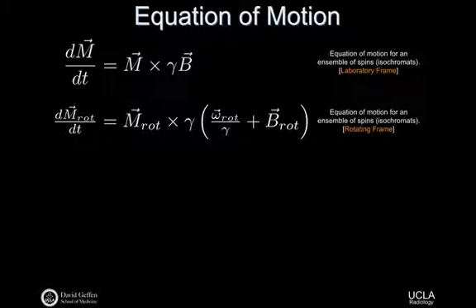So we'll see in specific examples what this sort of term does. This term is always going to be there. This is what effectively transforms us into the rotating frame, simply including this term here. The next thing we have to do then is define what is the B field in the rotating frame, and you'll see how this ultimately simplifies a little bit. So again, the only thing to really remember from this right now is that adding this term and changing our nomenclature a little bit is what puts us into that rotating frame. And you'll see how that becomes a useful thing in just a second.